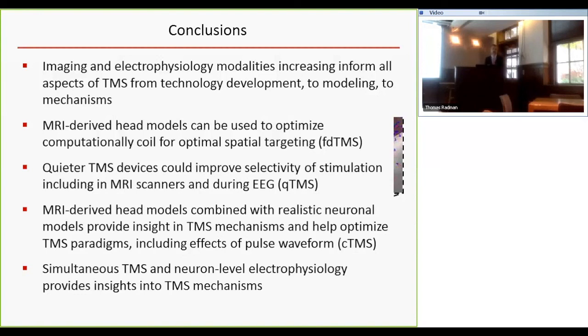So this was essentially a comparison of multiple thresholds. Just to repeat the question, it's whether, when we have comparison between simplified models and measurement data and our more complex models for thresholds, we're mostly looking at ratios, because in terms of the exact absolute threshold, it can be off by some percentage, so that means that you have still some factors to tweak in the model. So what's more important to us right now is to look at the ratios, because it shows difference, and there we normalize, what we did is we normalize something.